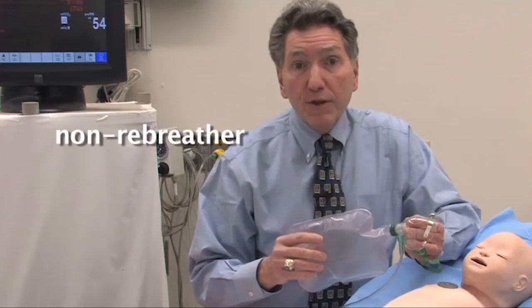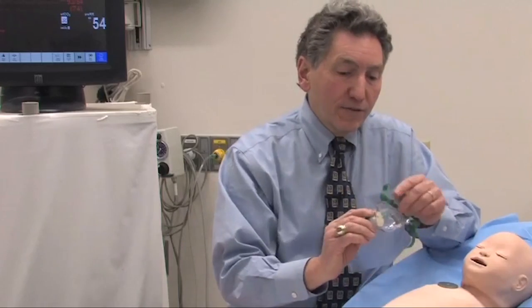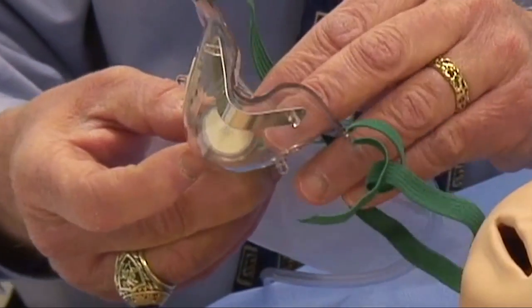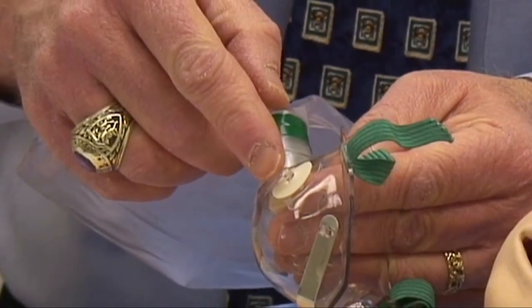It's also called a non-rebreather bag, and the reason has to do with CO2. Conceivably, if you put a mask and bag over the baby's face, they might blow CO2 into the bag and re-breathe it — something you don't want to happen. The reason it doesn't happen is because of these little flap valves. When the baby breathes in, this valve opens and gas flow comes into the mask and into the baby. When the baby breathes out, that valve closes and this one opens and the baby breathes out into the room. So it's one-way flow: bag to baby, baby to room — effectively keeping the baby from re-breathing any CO2.